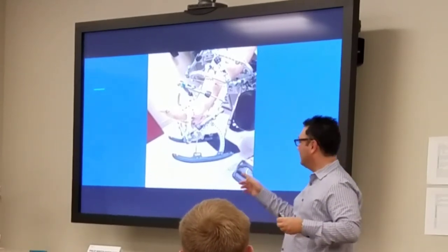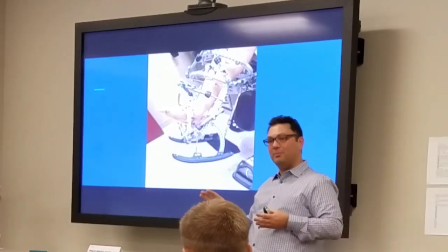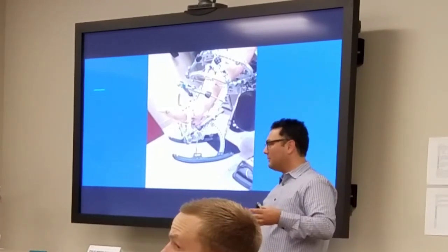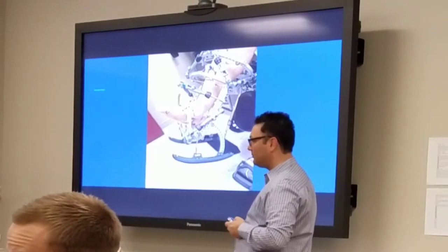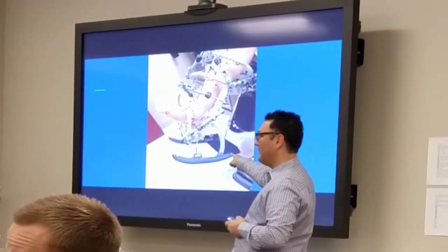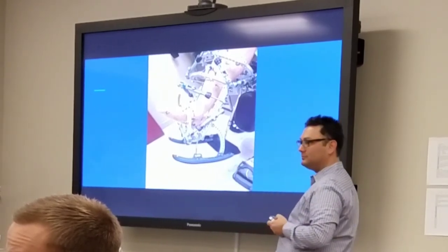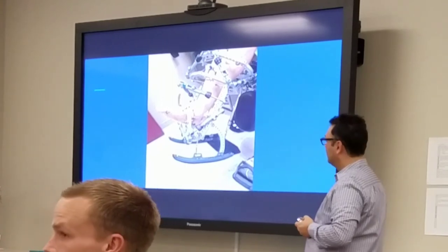Like this patient, she felt good, but it wasn't so stable. And so you're saying not attach the second rocker rail to the frame, you're just attaching it to the rocker rail? Correct. Let's attach those two together, an axle between them, essentially, like a snowboard.